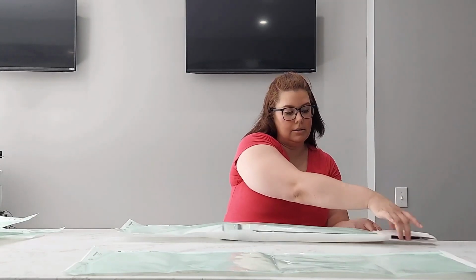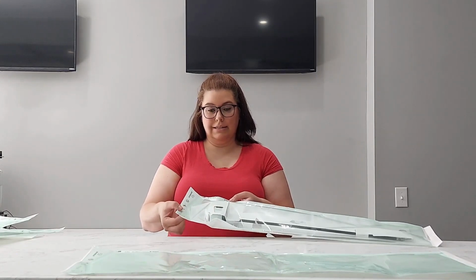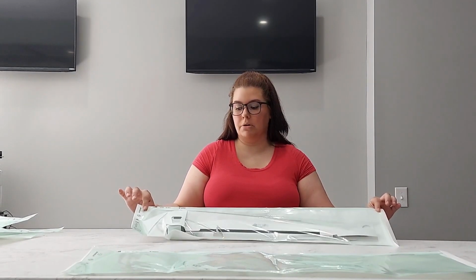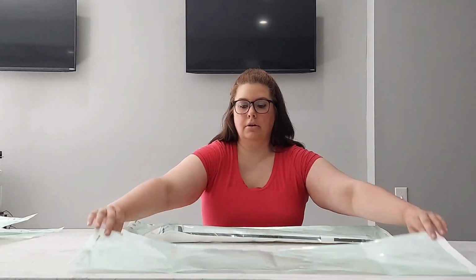Based on aseptic practice, you are going to want to put the box name end on the sealed side so that when they open it up, they're going to pull this round tab so they can pull the instrument out and use it. These are 100 GSM, which is a sturdier peel pack than the normal ones we're used to. But we do have two different sizes. So there's this one, and then there's a little bit bigger one. So should you want a double peel pack, you're more than welcome to.